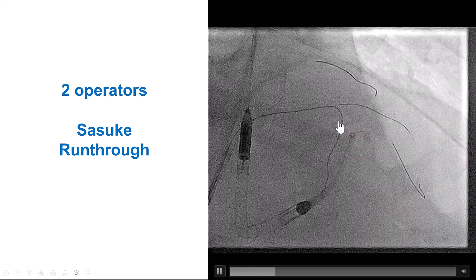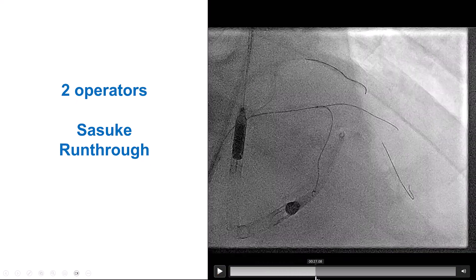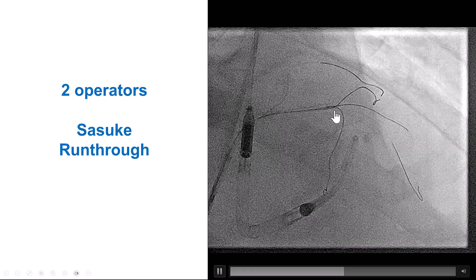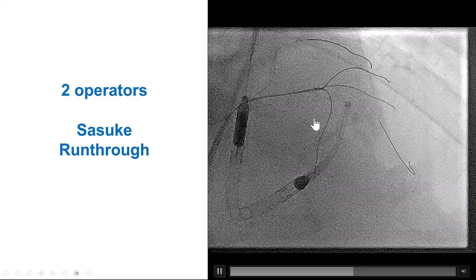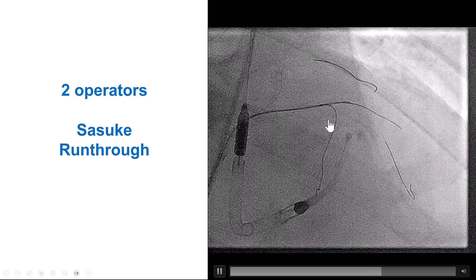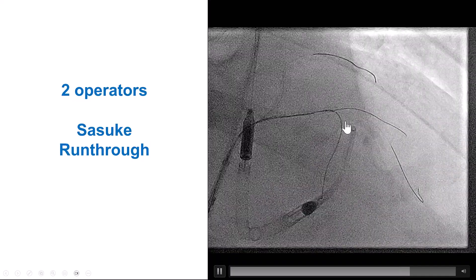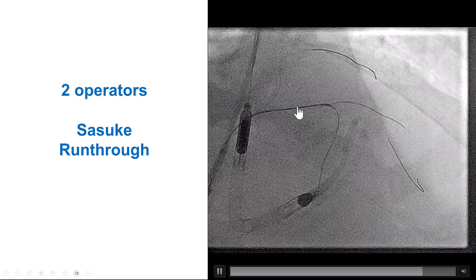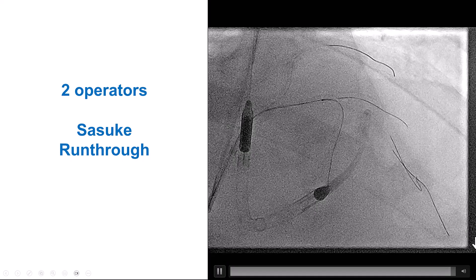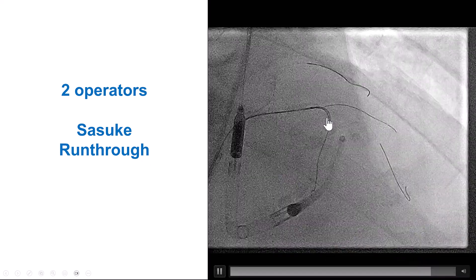We thought we might try to advance a workhorse wire over the dual-lumen microcatheter through one of those wires. We put the dual-lumen microcatheter over the septal wire and delivered it close to where we thought the proximal cap was, then probed with a workhorse guide wire. We did not want to use a polymer wire, as this would be more likely to enter the extravascular space. The wire went into different branches — back in the septal, back in the diagonal, branches of the diagonal. This was a two-operator maneuver: one operator moved the wire while the other pulled back the dual-lumen microcatheter to recalibrate position.